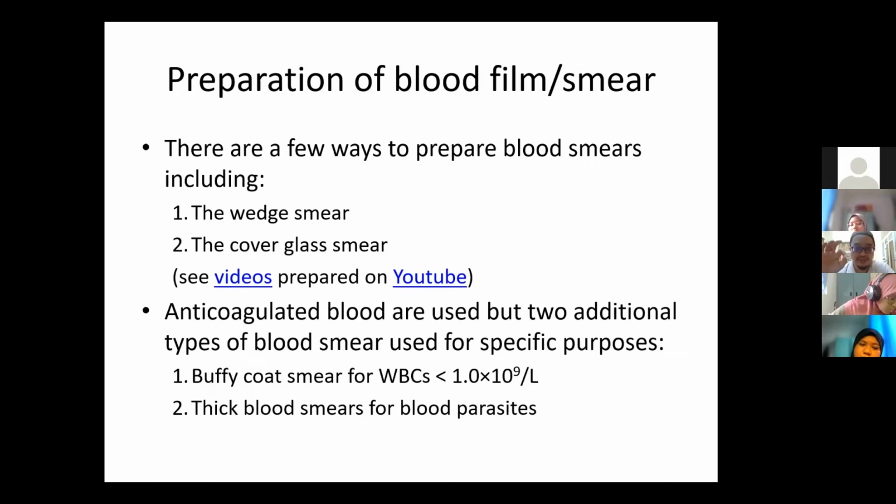Ada yang saya tengok pakai chopstick. Ada yang pakai a much more commercialized way, dia ada cap yang boleh tutup dekat EDTA tube tu. We uncap and put on another one, then we turn the tube down, and the blood will come out from the hole in a very nice drop, the right size.